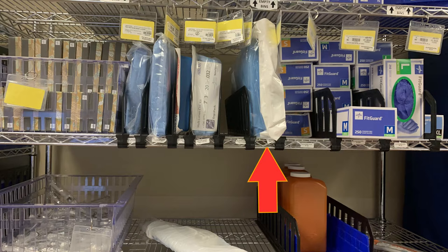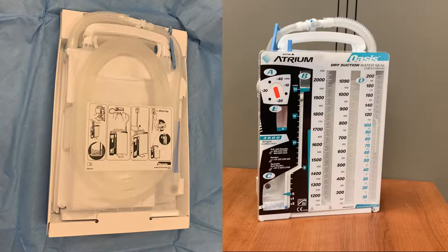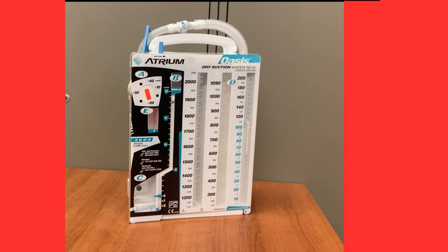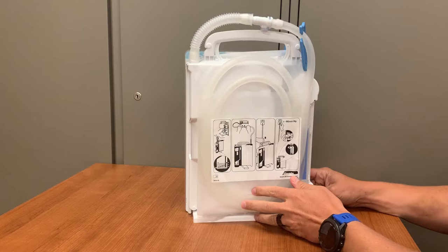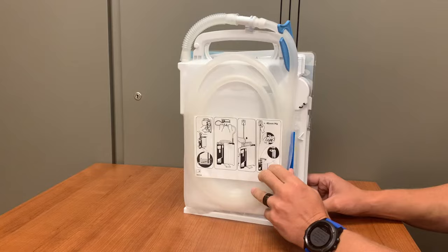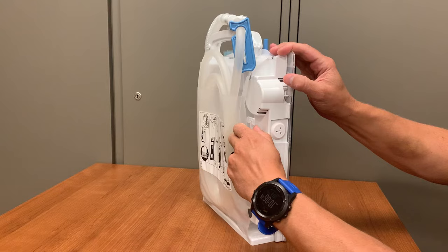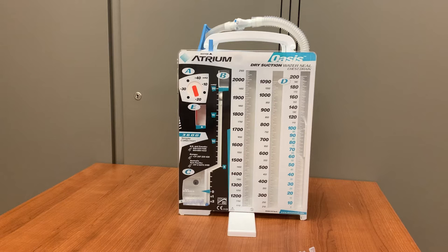The Oasis can be found in the pod rooms on all units. When opened, it will look like this. It is sterilely packaged; however, when we need to set up a new unit for a patient on the floors, aseptic technique will be used. On the back of the Oasis, simple setup instructions can be found. Also on the back, a small container of sterile water is attached to the system. Remove the water, then place the drainage system on a stable surface. Any time the Oasis system will be resting on a surface, utilize the attached stand.